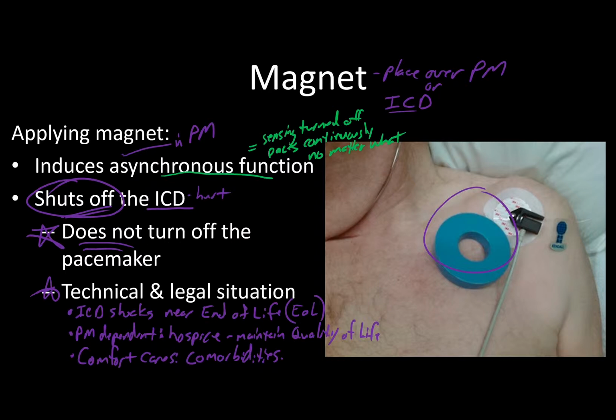In the pacemaker dependent section, you look at hospice scenarios, and unless the patient or family has a very, very, very strong desire to discontinue the pacemaker, it's left on for quality of life.